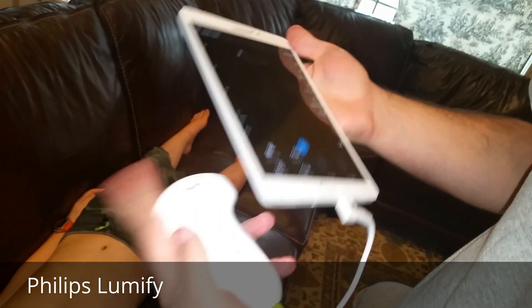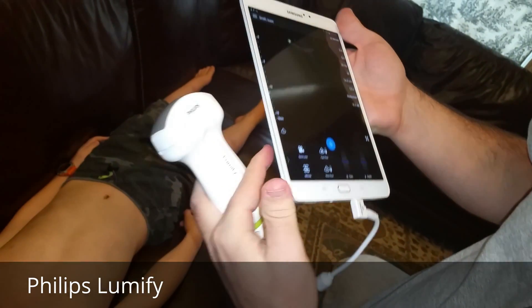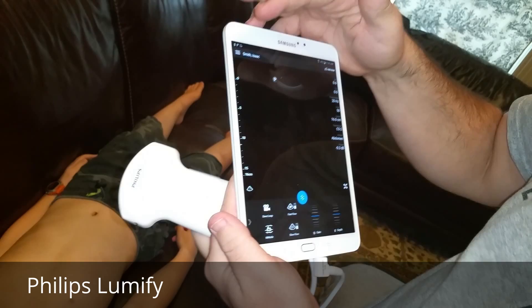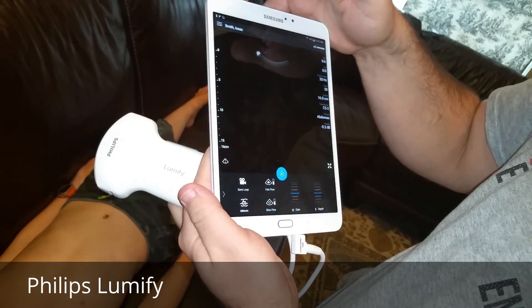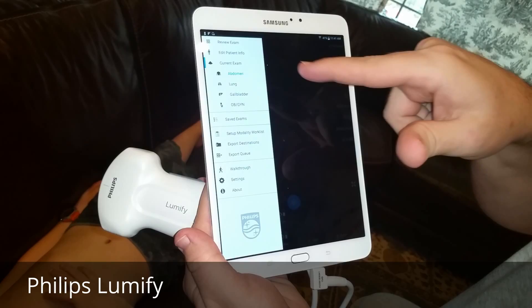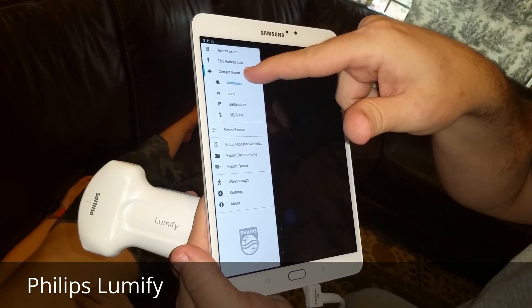This is a curved linear probe, typically meant for doing abdominal exams. If you're handy with it you can do some cardiac exams as well. You can also adjust it for lung, gallbladder, or OB-GYN — but we're going to concentrate mostly on abdomen today.